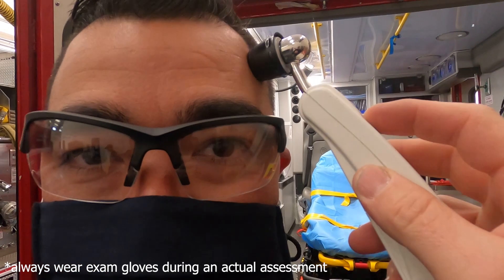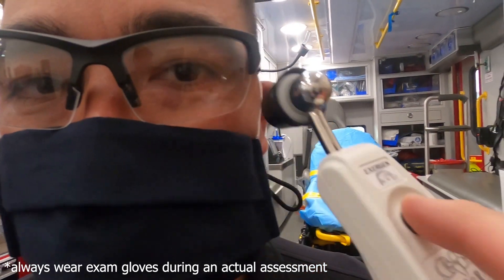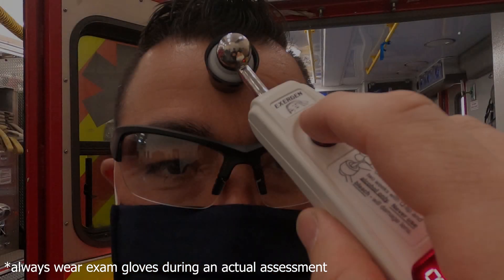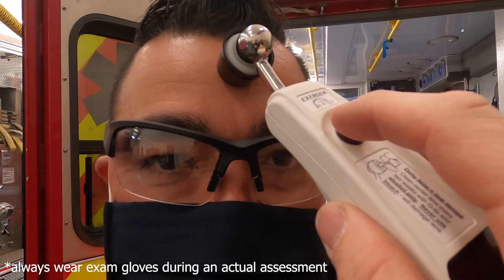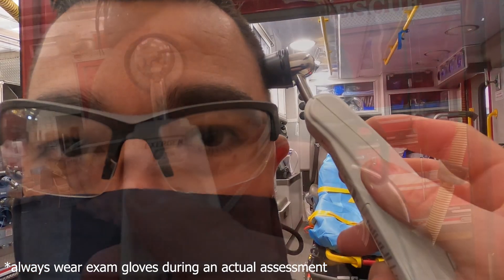Obtaining a temperature with the Exergen Temporal Thermometer is incredibly easy and user-friendly. Simply follow these steps: place the probe on the center of the forehead, depress the red button, and ensure that you keep the button depressed for the entire measurement. Maintaining contact with the skin, slowly slide the probe across the forehead into the hairline.